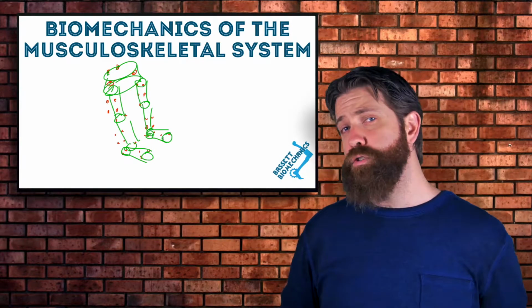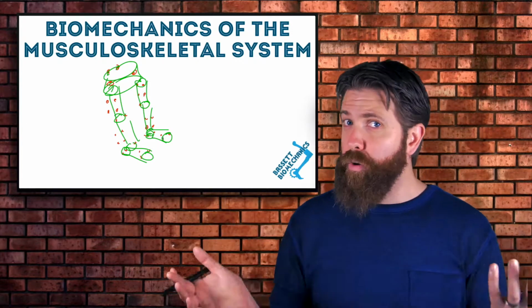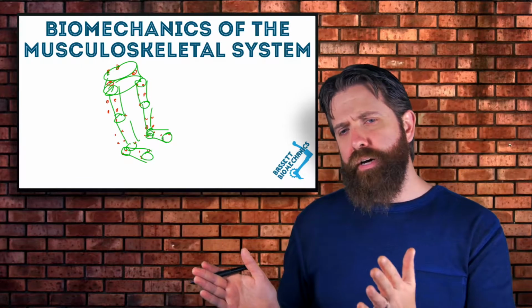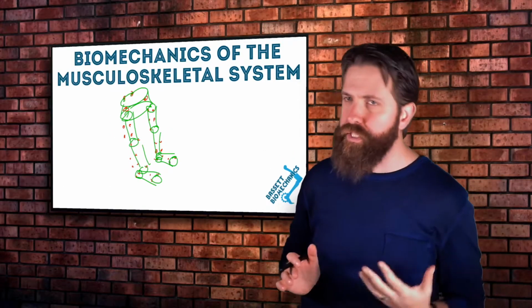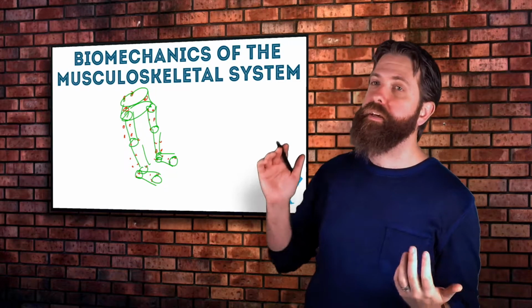Now, this doesn't mean that, for example, Leardini's marker set is not valid. In fact, I'm a huge fan of his marker set as well, from the IOR, Istituto Ortopedico Rizzoli, which has great clinical applications. My preference ends up being a cluster marker set, but you might have reasons to use a different one.